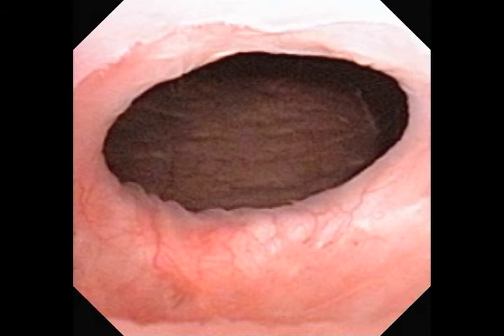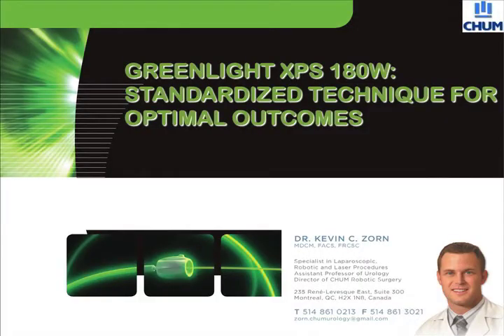Here is a cystoscopic image 6 months after surgery demonstrating re-epithelialization of the bladder and therefore a successful outcome. This completes our surgical technique for standardized outcomes by Dr. Kevin Zorn.